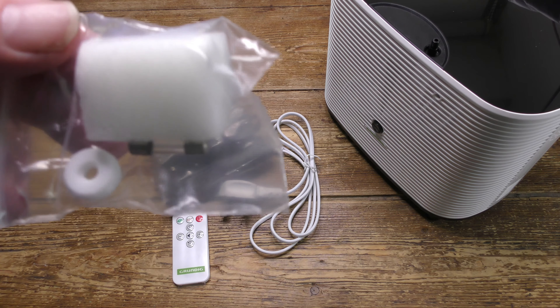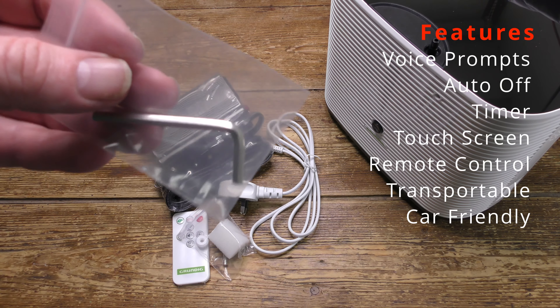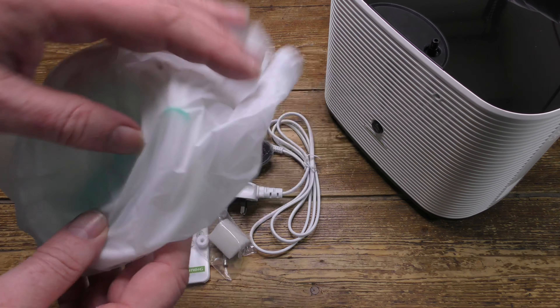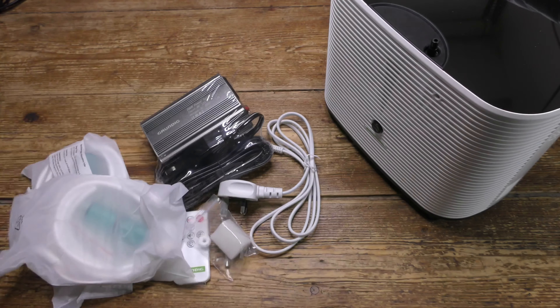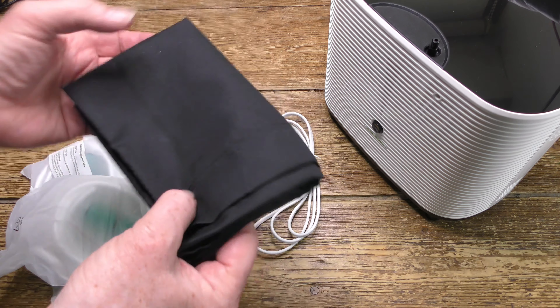Here's a bag of spares, and there are two of everything, one pre-fitted. This is the allen key, used to remove the strap. Here's the first of the two breathing tubes — one goes into the nose, the other sits in front of the mouth like a sort of microphone. There's a carry bag for the main unit.